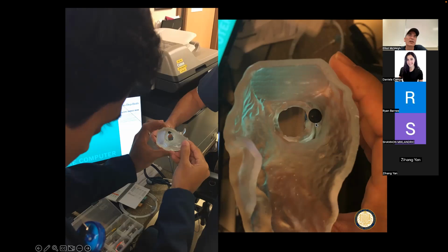If you have, say, a hole in your septum between your left ventricle and your right ventricle, and blood is squirting through there and causing some malady because you're mixing all your blood, you can put one of these plugs through the hole, tighten it up, and just plug the hole shut. And they're used a lot.